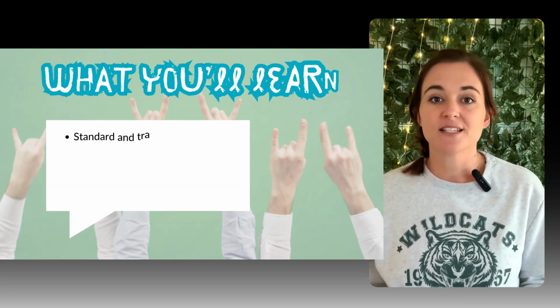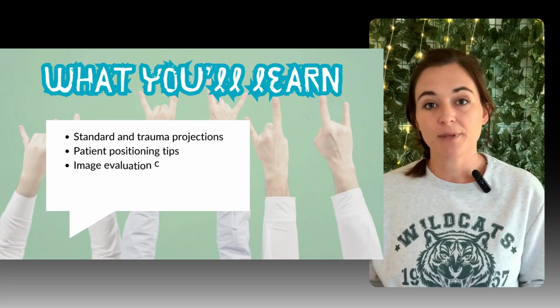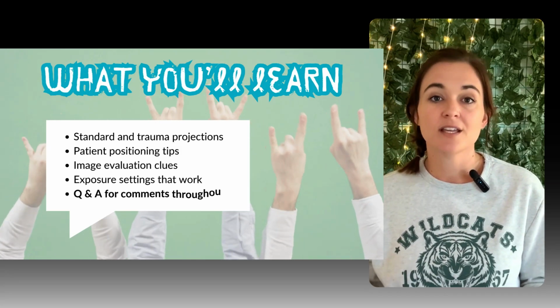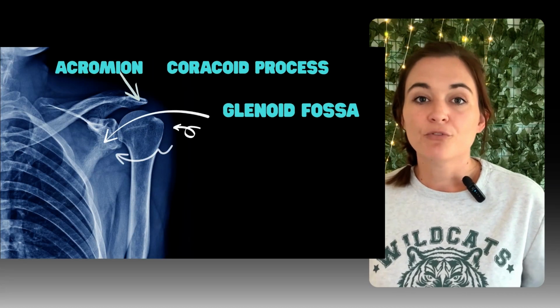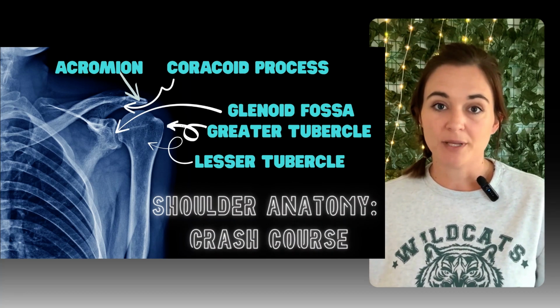Today's focus is the 4-view shoulder series every tech should know: AP external rotation, AP internal rotation, scapular Y, and the Inferosuperior Axial or Lawrence view. Let's go. Before we jump into positioning, let's ground ourselves in shoulder anatomy.